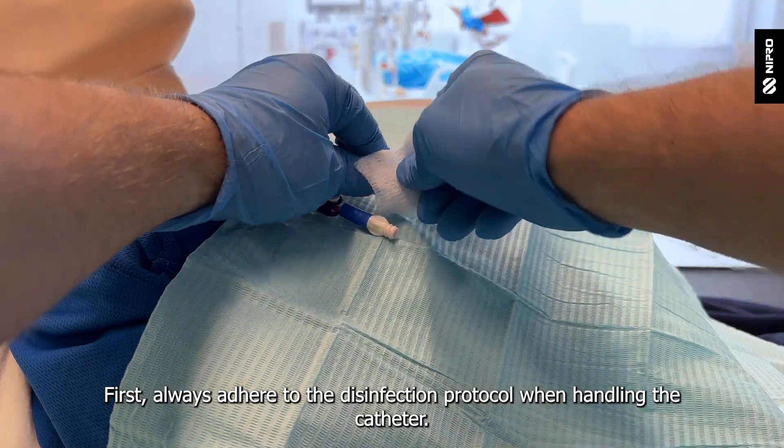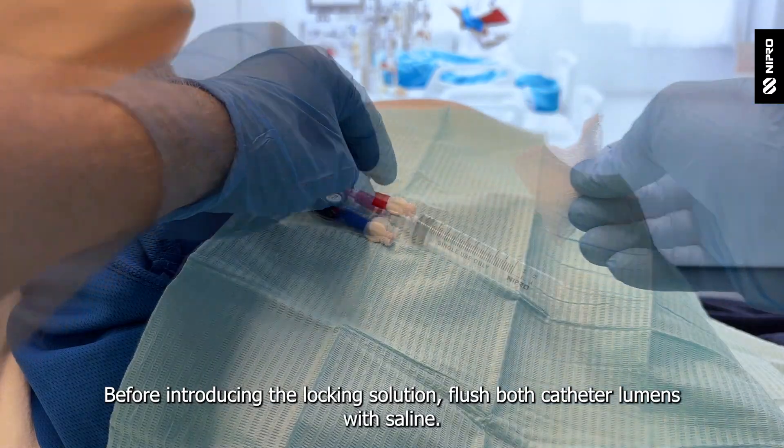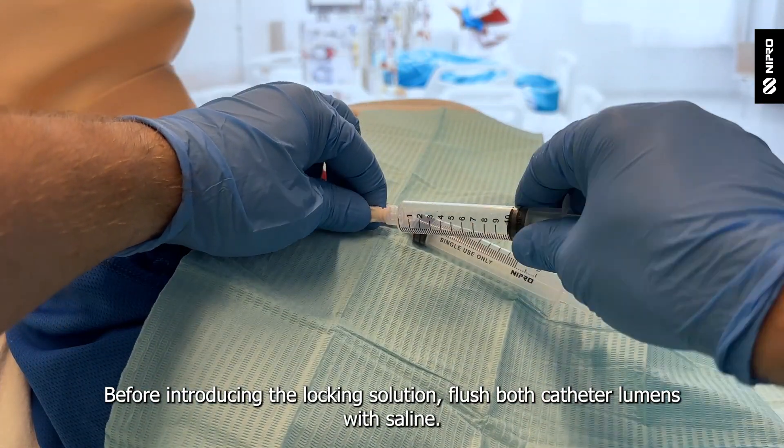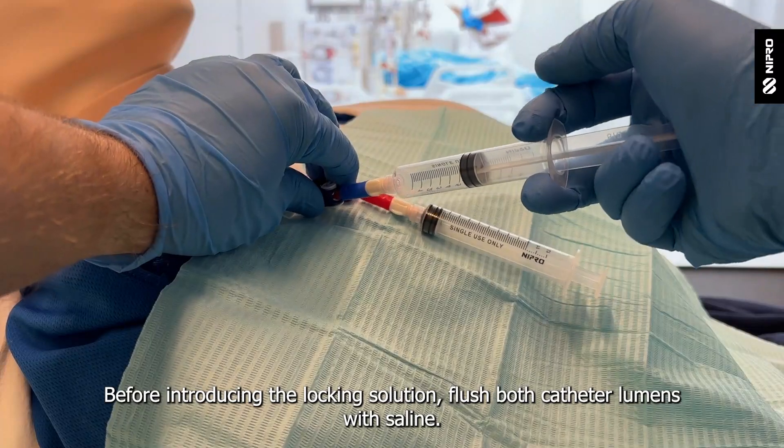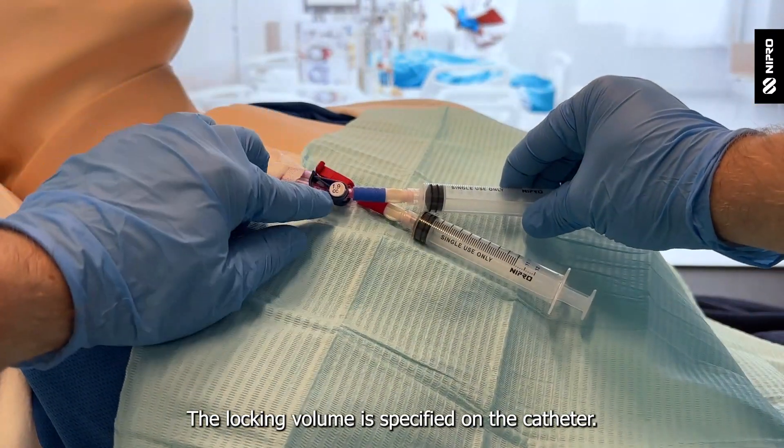First, always adhere to the disinfection protocol when handling the catheter. Before introducing the locking solution, flush both catheter lumens with saline. The locking volume is specified on the catheter.